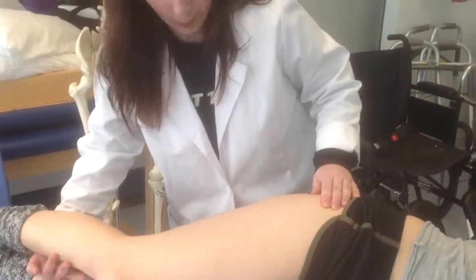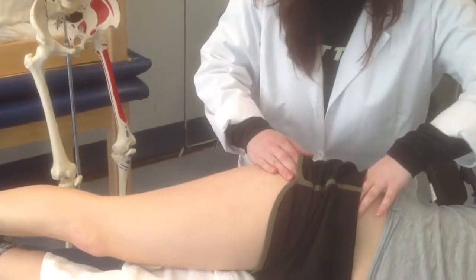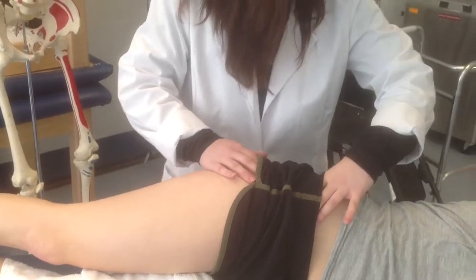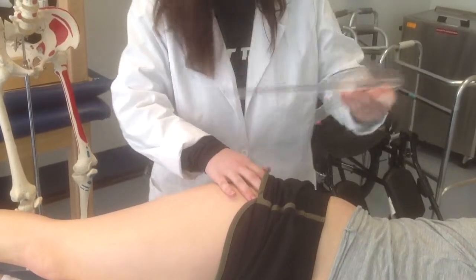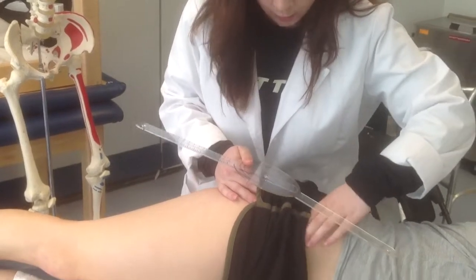Rotation of the femur. Now I'm feeling again for the ASIS and PSIS. So I have my axis and my stationary arm, and I'm stabilizing at the pelvis.